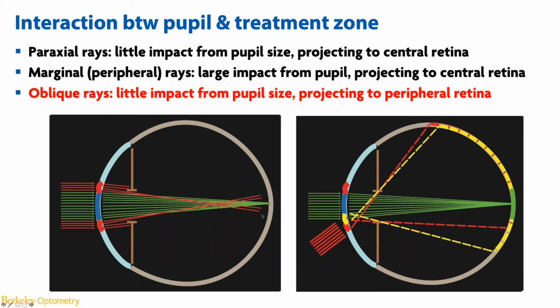And if this theory holds, then really pushing for the paracentral steepening to be inside the pupillary margin makes a huge difference.